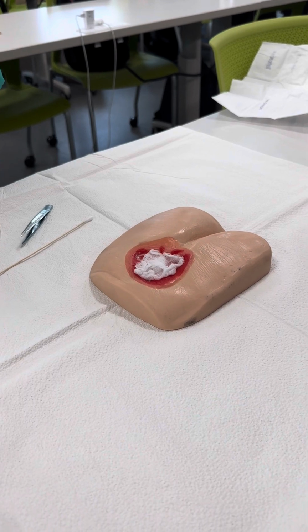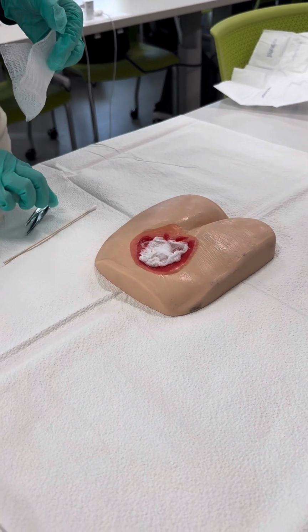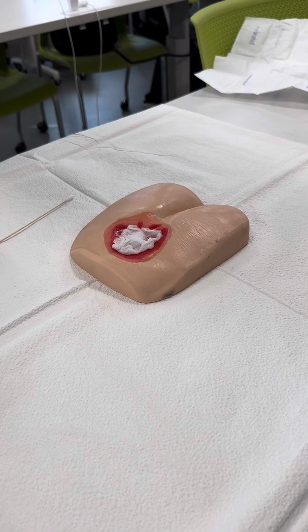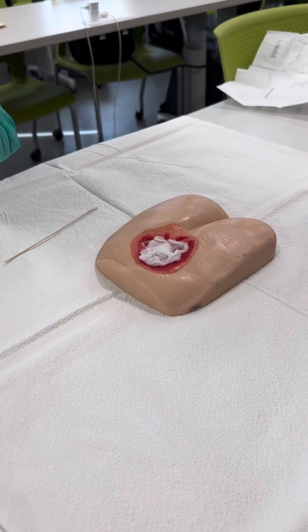Okay, should we pack another one on there, or should we just go with the dry one? I would do one more. You want to make sure that wet gauze is touching all around that wet granulated tissue, touching all the sides of the wound. When you take it out, it's going to help get all the dead stuff on the way out.